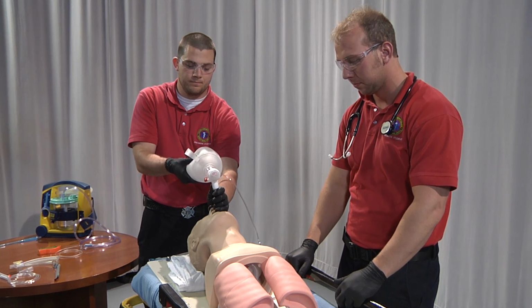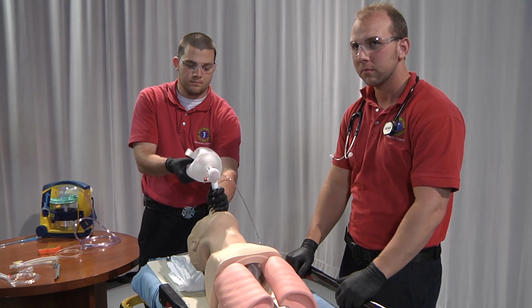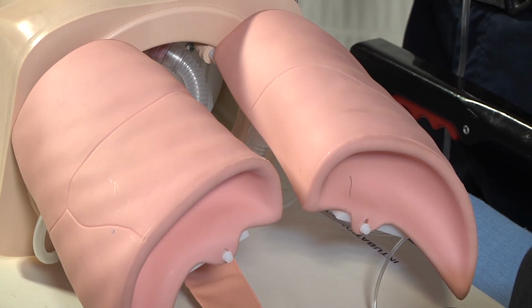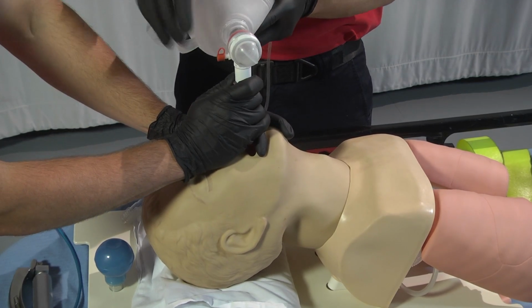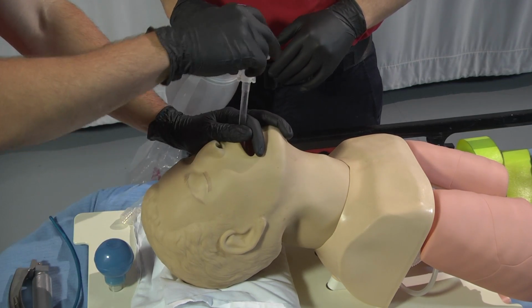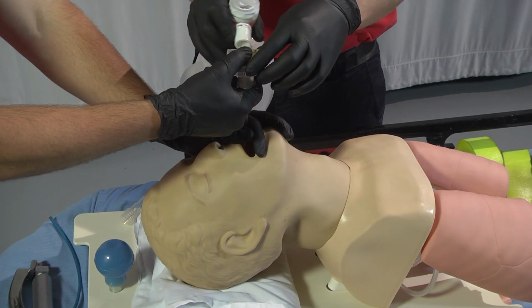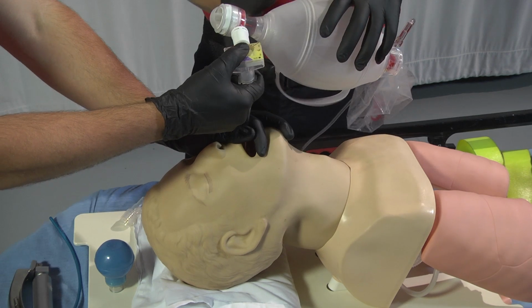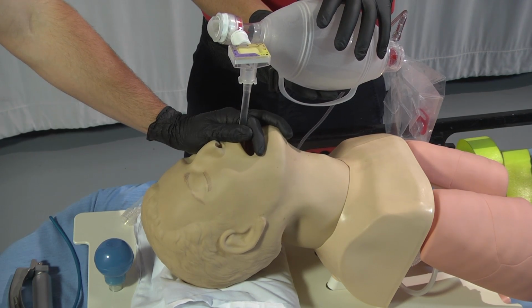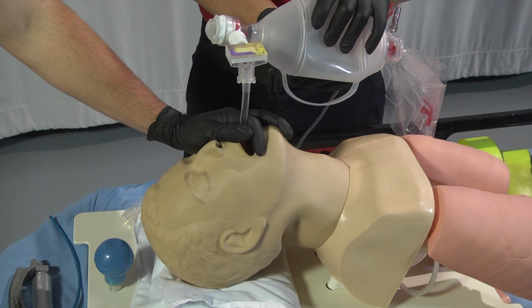1. Condensation noted in the tube. 2. Visual chest rise and fall. 3. Esophageal detector device. This should be done prior to first ventilation. 4. Colorimetric device. Remember to take into account low perfusion states such as cardiac arrest, as colorimetric devices may not indicate proper or improper placement.